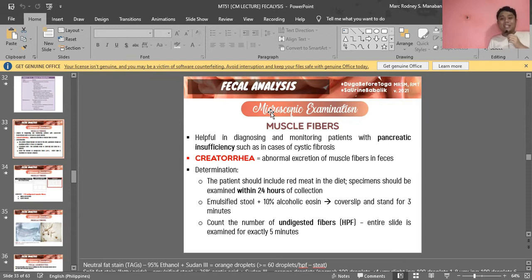Now, of course, ganun pancreatic insufficiency man. Because again, these muscles or mga proteins, right? Enzymes also are secreted from the pancreas to digest these proteins. So therefore, if wala siya na-digest, imuhang muscle fibers, so possibly yun na problema sa pancreas. Kaya wala siya nihatag og enzyme. Okay? Alright. Now, determination, the patient, of course, kailangan siya mukhaon og red meat in the diet. So, lami kayo siya dyan, no? Kaya makaano dyan siya meat, okay? But of course, na source of meat or meat fibers, alright?